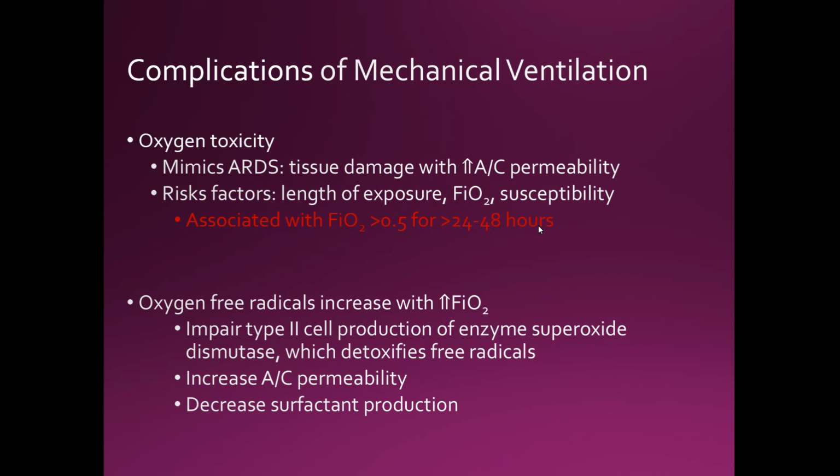Now, if I had someone on a trach with a large volume nebulizer, cool aerosol, they would crank up the FiO2 to 100%. On the dial of the large volume nebulizer, it would have the FiO2 and the flow.